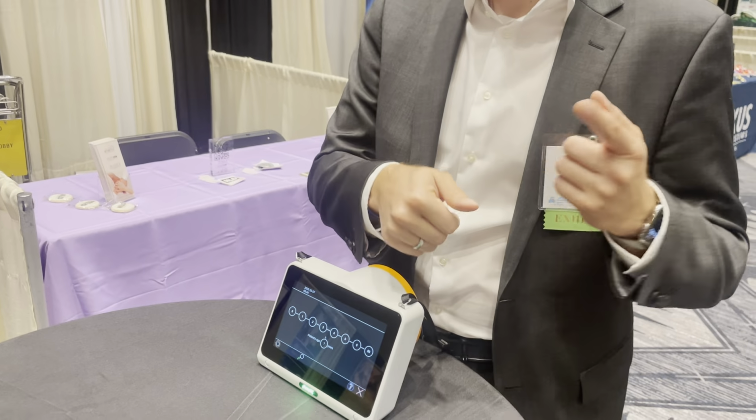So once the sound comes, this is the attention grabber. And in a silent environment, it's gonna be pretty loud. So the child goes like, boom, what happens? Looks at you, if you're in the right distance, measurement is over.